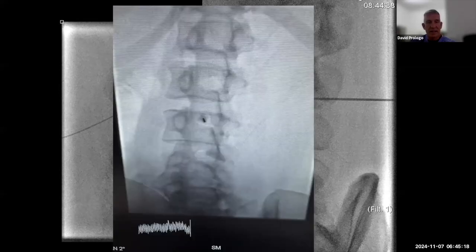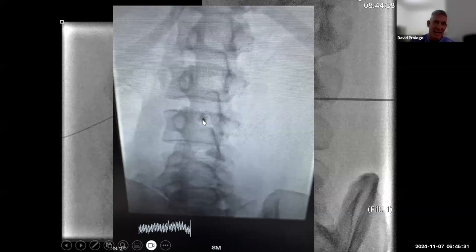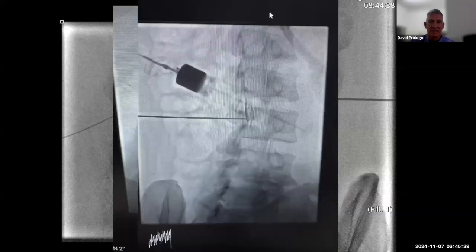I am proud to say that we did this morning at Muhimbili Hospital. And I won't go through the steps again, if you guys have had enough of that. We obliqued for our target in the end. This is our down the barrel view for our midline epidural that we did a couple of hours ago. And then this is the lateral, steep oblique. And here's that straight line, right?